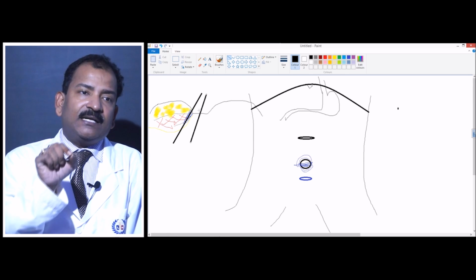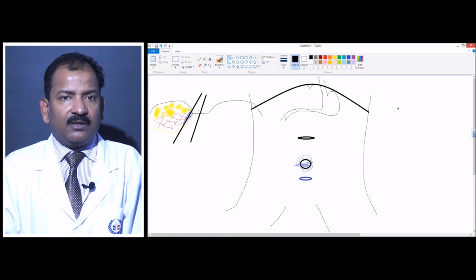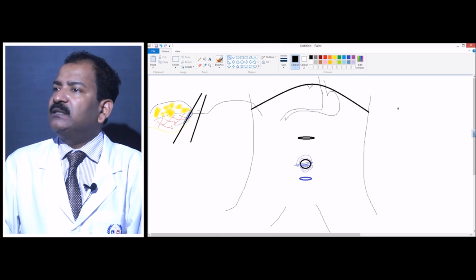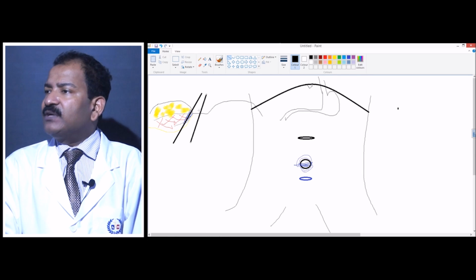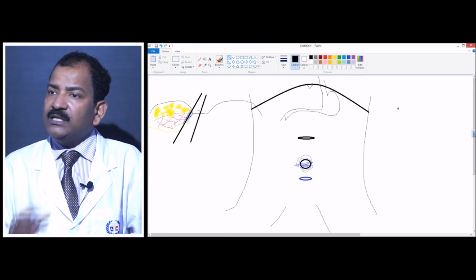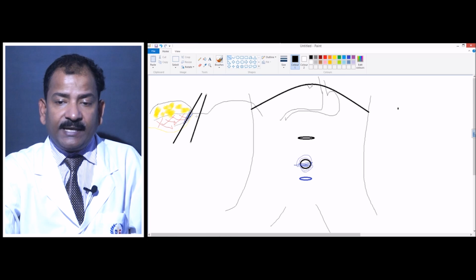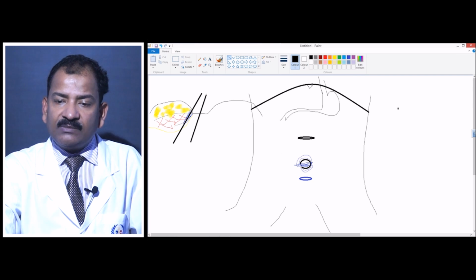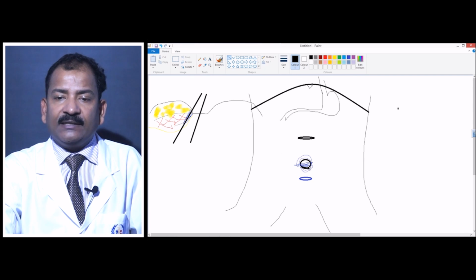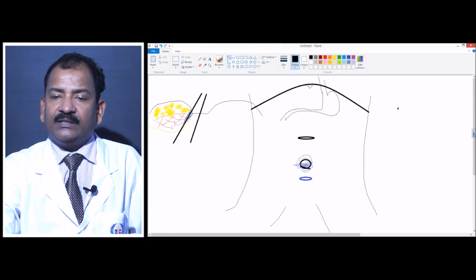It is a pitted area, confluent skin, corrugated skin. So if you go through the umbilicus, there is a possibility that infection will be more and hernia will be more, because it is the thinnest part of the abdominal wall. That is why people say that if you go for the smiling incision, you will keep on smiling, and there will be minimum chances of hernia or infection.